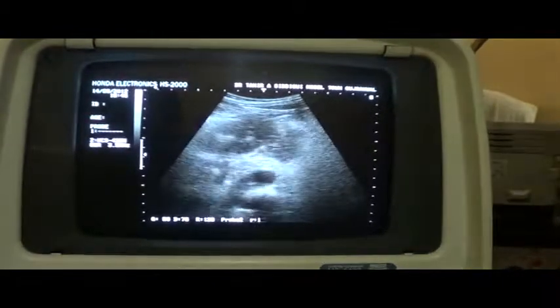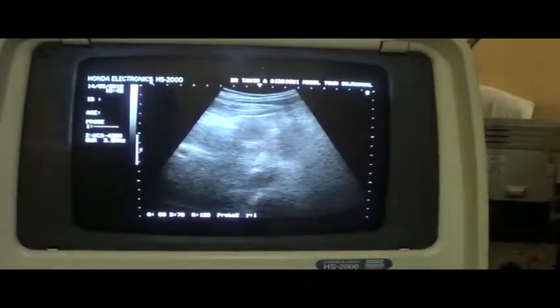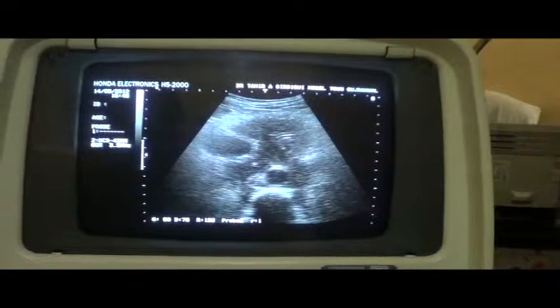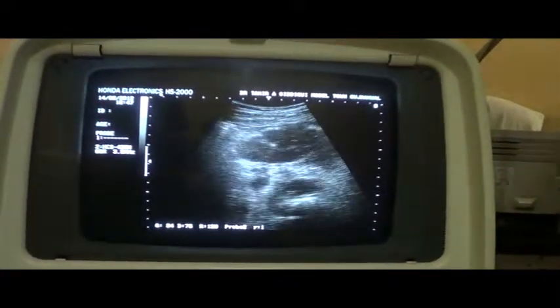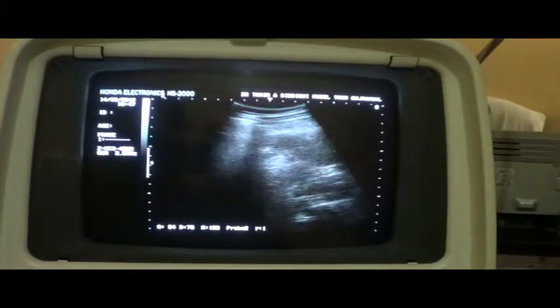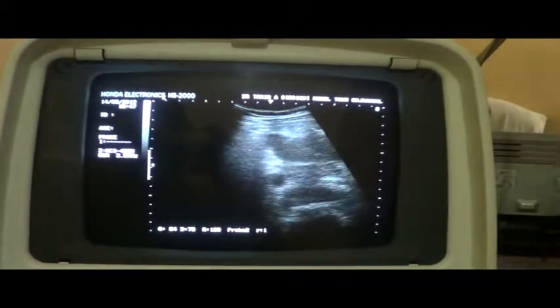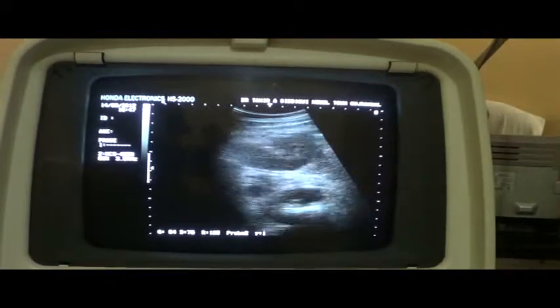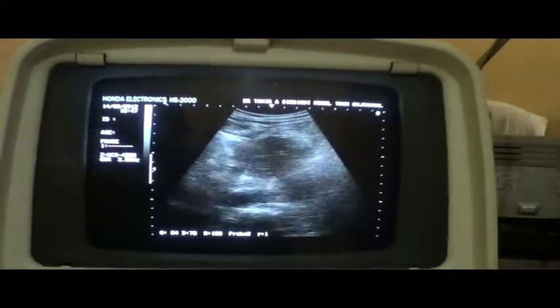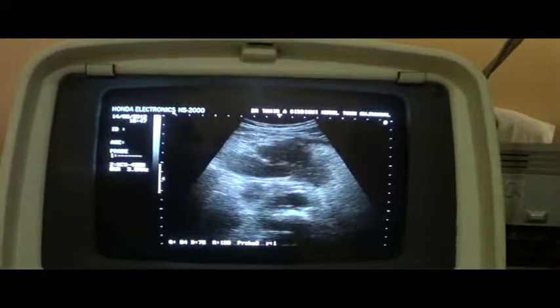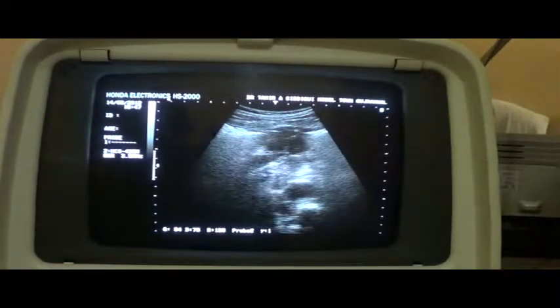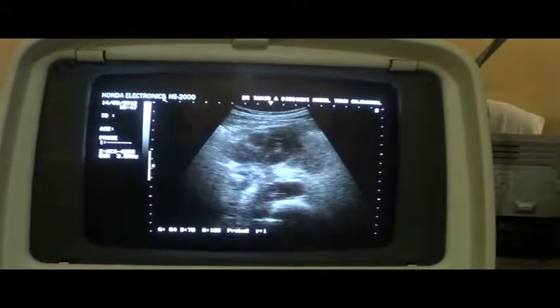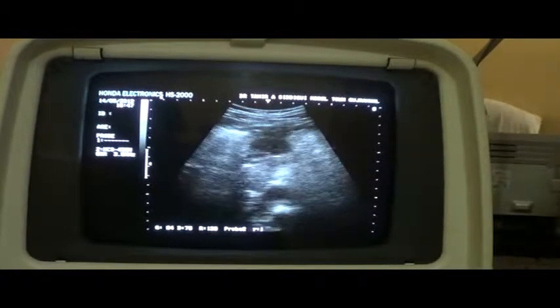When you want to be more sure, you ask the patient to stand up and then scan the patient in standing posture. Because this is the aorta and IVC - this is the aorta, this is the IVC, this is the mass. So here is the pancreas. Can we still see the pancreas?